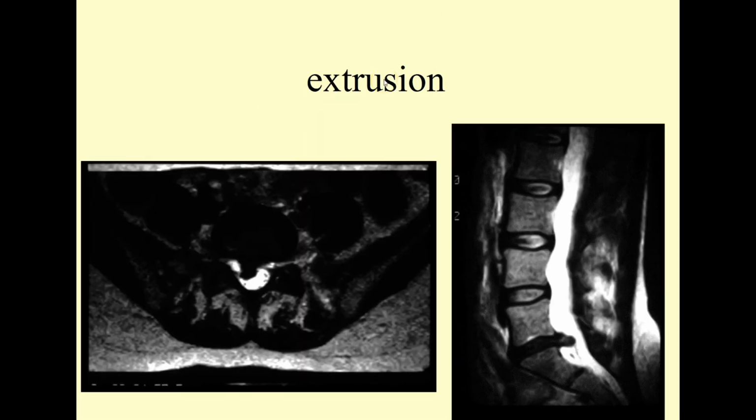Here we are again looking, now in this case, at an MR image. Find the bone, go to the outer layer, and if it's black, know it's dense. Dense bone will not signal on MR, whether it's under T1 or T2 or any hybrid conditions. For this patient, we see they've got decent hydration in the L2, L3, and L4 discs. Get down to the L5 disc, quite displaced.